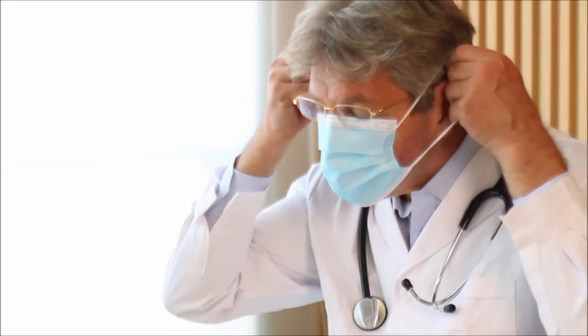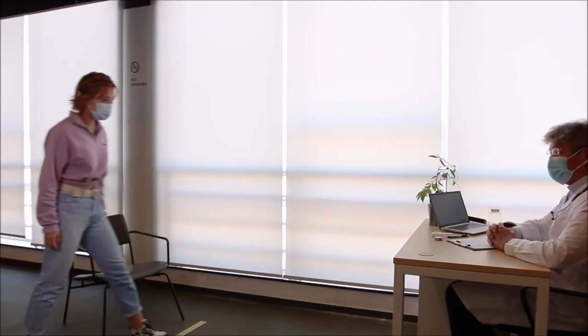Traditional stethoscope is iconic, but the pandemic has changed the way we live and work. Cross-infection needs to be avoided.